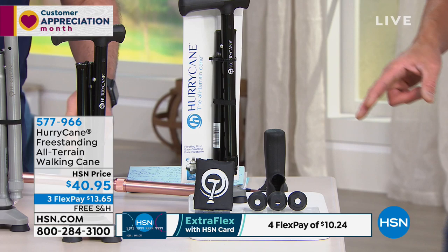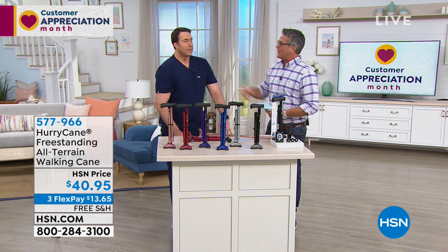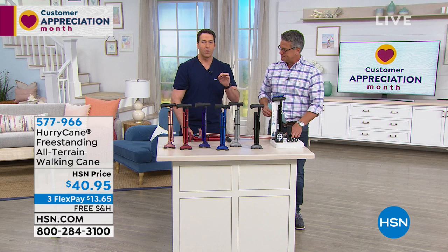So if you want to help mom and dad or grandma or grandpa, or somebody that's just convalescing an injury, the HurryCane is what you need. Drive Medical makes the best in the business as far as these products go. There is a reason this is the number one selling cane in America, and you've probably seen or heard of the HurryCane before because it is the best.